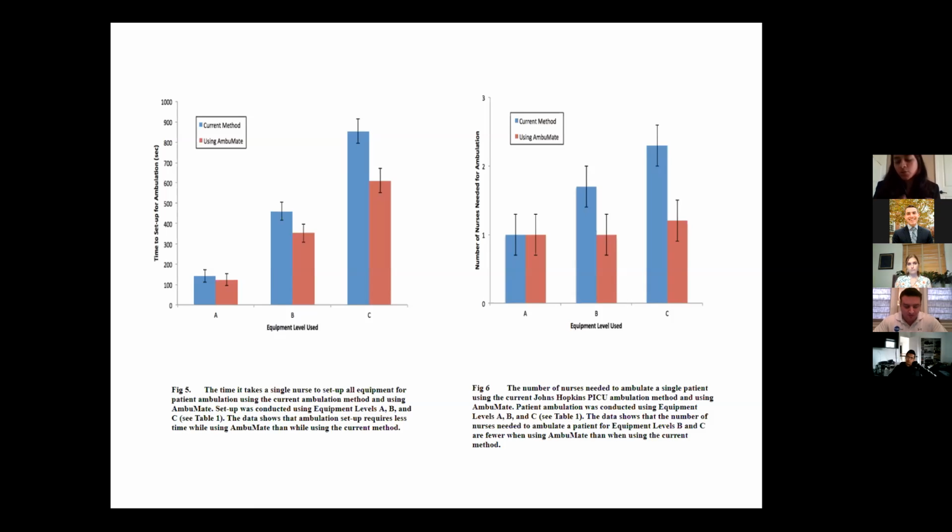We wanted to verify that those mechanisms were preferred by the nurses. And once we verified that, which we have done with our studies last winter and in the spring, we're looking at changing those in our prototype, really just finalizing it because we do have the foundation of it completed. We have been working with Johns Hopkins Technology Ventures to pursue IP. So the idea is that we would pursue a patent for the mechanisms that we use for the patient support. So the chair and the wire and tube management system specifically, those are very key parts to it. And obtaining a patent through them to protect that technology in that way.